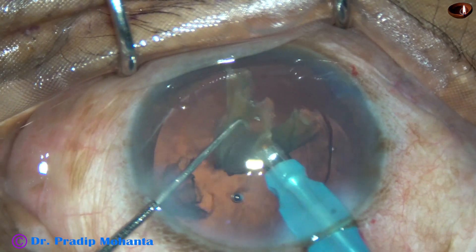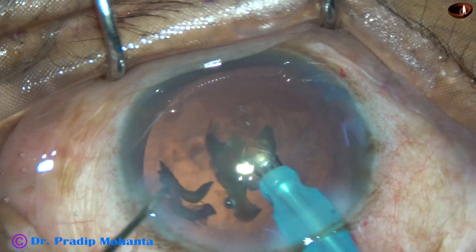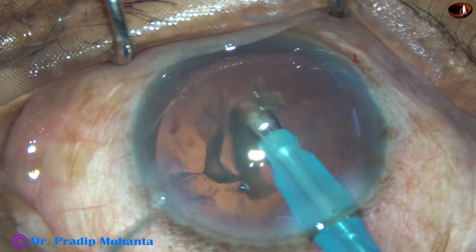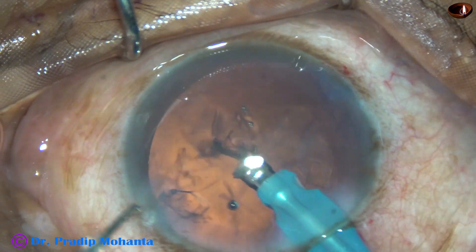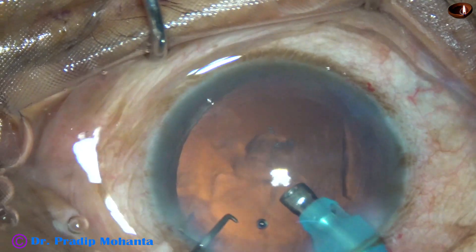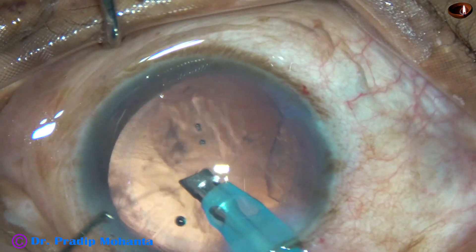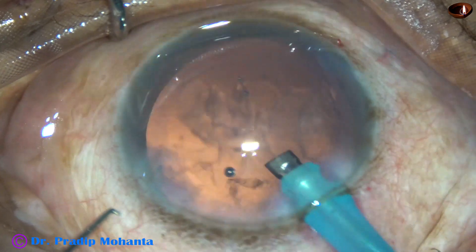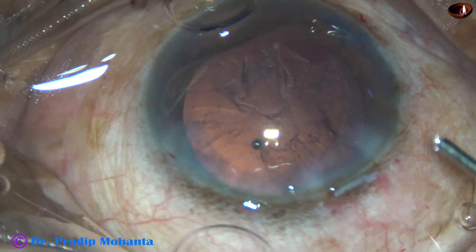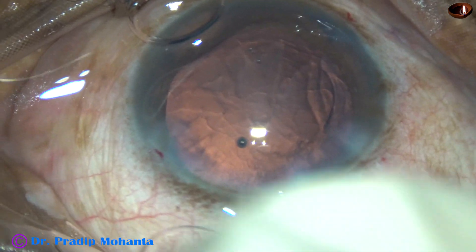Whenever you find this situation, just tent it up, inject visco behind the pieces, and do a surgical strike with high ultrasonic energy on the leathery band joining the fragments. Now when this small piece is there, I change the settings. At this time the ultrasonic energy as well as the other parameters are low. During emulsification of this last bit of nucleus, vacuum was only 250 and flow rate was 25, whereas previously it was 40 ml per minute flow rate and 450 mmHg vacuum.